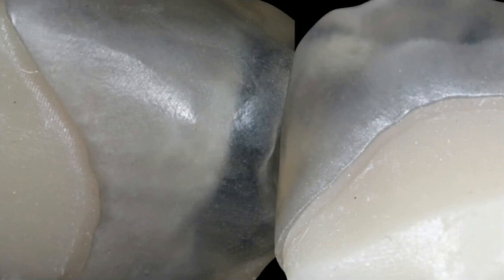Now, this is using a microscope to see how the margins are sealed, because when I'm designing these restorations, in my parameters and my margin, I bump it up to 150 so I have a thicker margin. You can see it seals into the margin or into the tooth, but this little step, what are you going to do on that step? You get these polishers, and all you do is just blend it in. Just remove that little ledge that you have, just polish it, and that's more than enough that you need, okay?